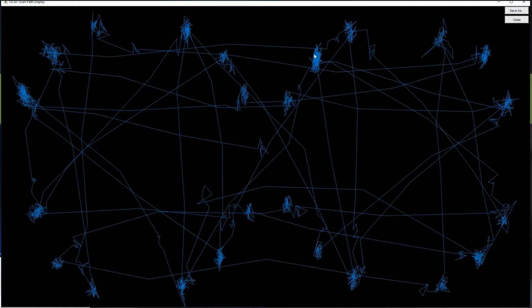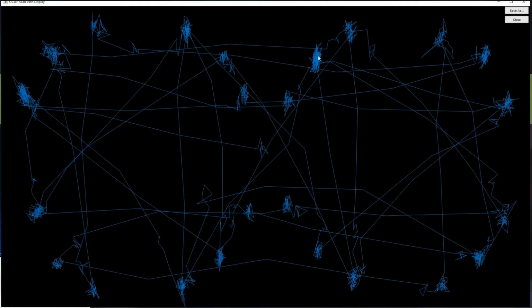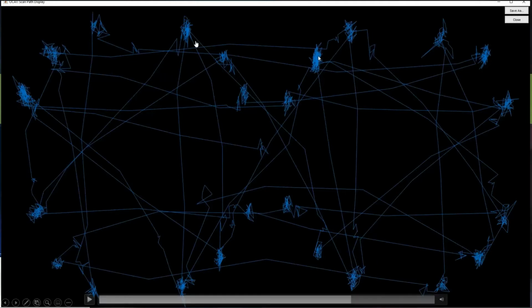And you'll see sometimes some deviations between points. Like here, you can see the scan from one point to the next was very straight, versus here there was a little bit of a deviation. They went up and then over. So when you look at neurological diseases such as Parkinson's and Alzheimer's, you'll see a lot noisier microsaccadic movement, as well as more deviations between points.